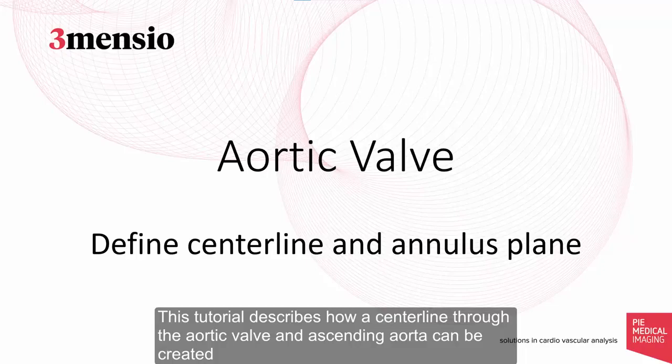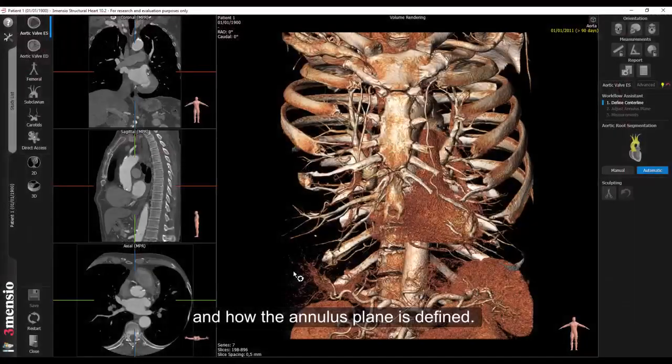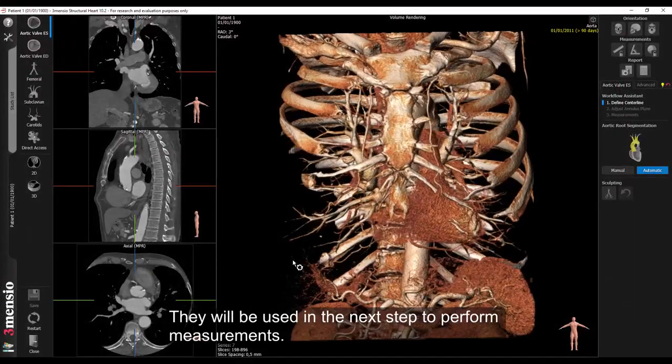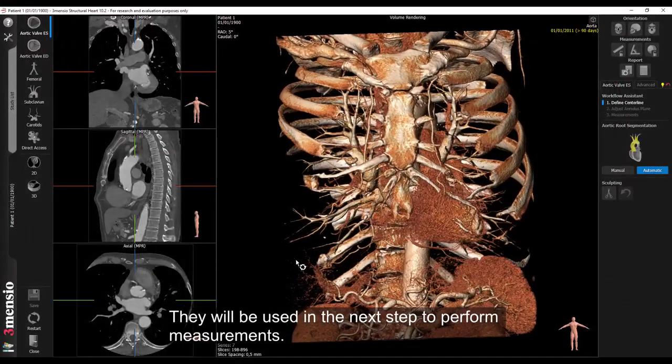This tutorial describes how a centerline through the aortic valve and ascending aorta can be created and how the annulus plane is defined. They will be used in the next step to perform measurements.